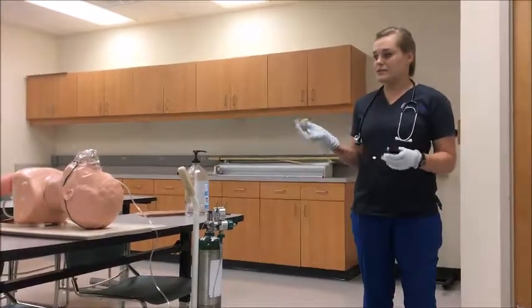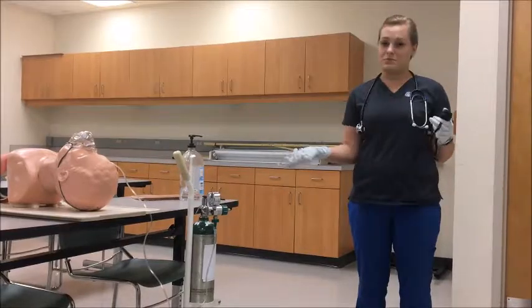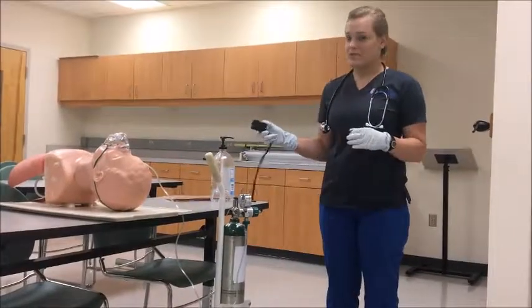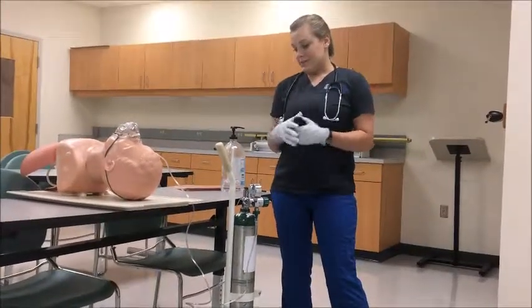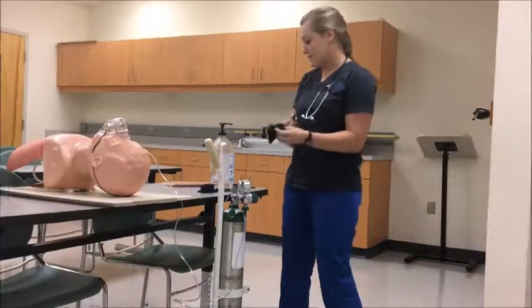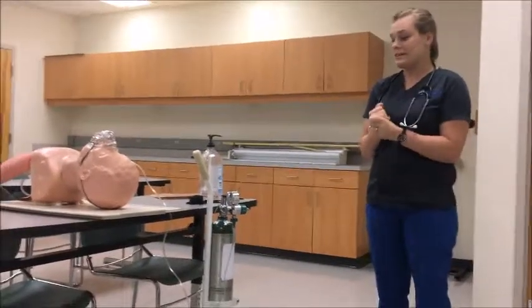The patient is doing okay, so there's no reason to adjust the flow rate. If the patient needed a higher flow or the doctor asked for one, you would just increase the liter flow. As a follow-up, place the pulse ox on the patient's finger to see if their oxygen levels are rising and if their heart rate is at a normal rhythm and rate. Monitor the patient, then remove your gloves, throw them away, hand sanitize, record all the data in the chart, and let the physician or nurse know of any problems or changes — and that's it.